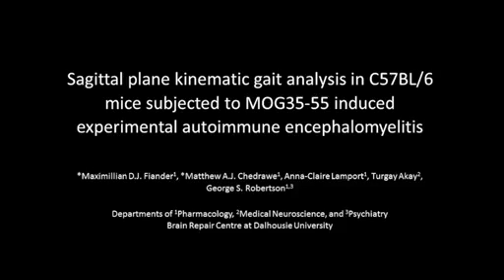The overall goal of this procedure is to measure functional motor impairments in the experimental autoimmune encephalomyelitis, or EAE, mouse model of multiple sclerosis, using kinematic gait analysis. The application of kinematic gait analysis to mouse walking behavior has been previously established and described by others.